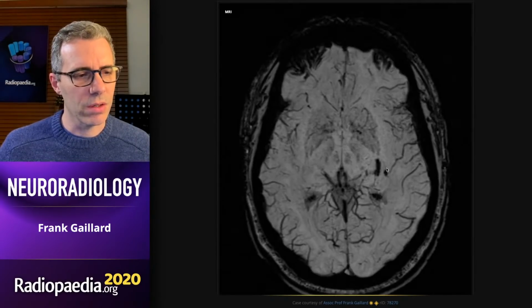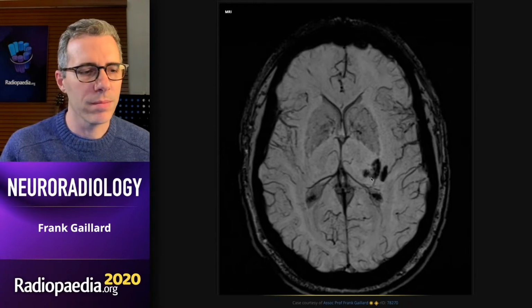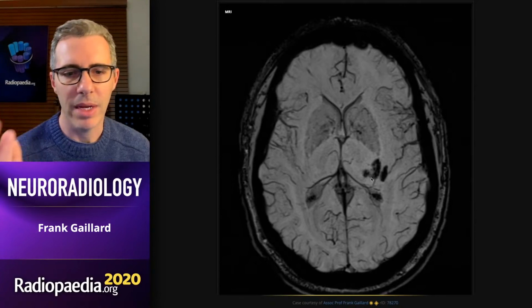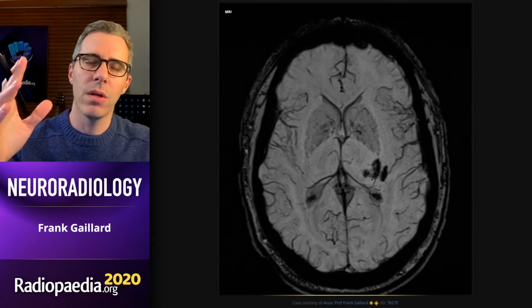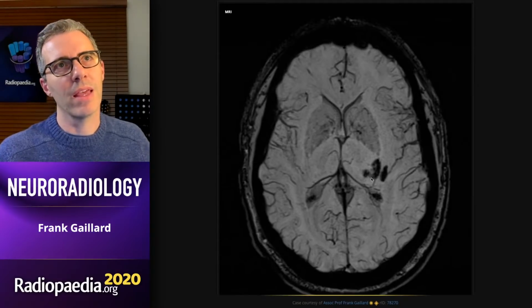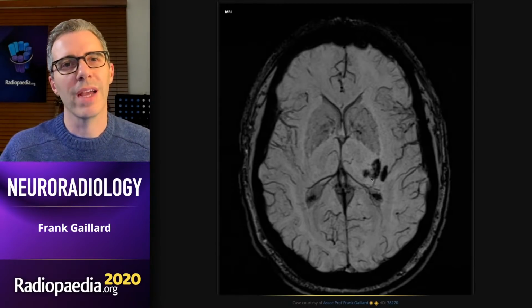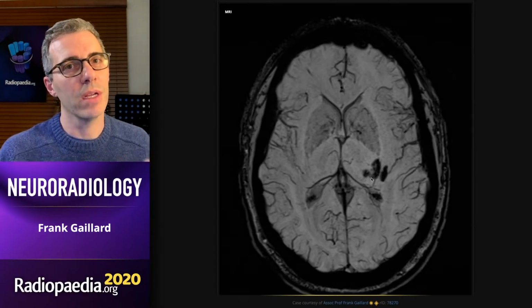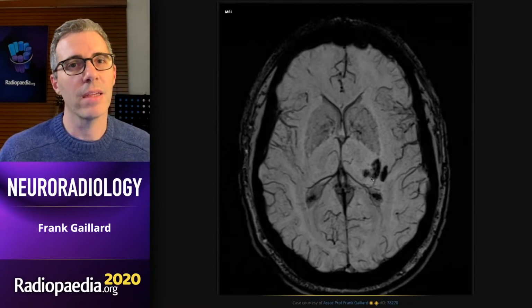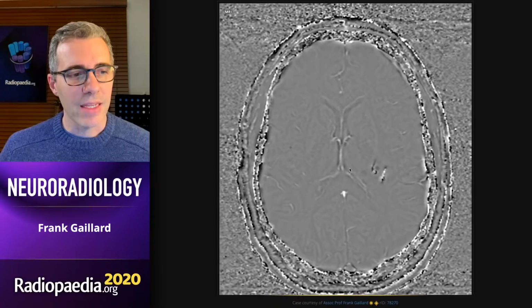So here we have these areas of susceptibility induced signal loss, but it doesn't really tell us on these maps what it's made of. Now, there are two ways that you can affect your magnetic field, and that's using paramagnetic and diamagnetic compounds. That's to do with whether they pull the field towards them or spread it out. So they affect the magnetic field in opposite directions, and the direction of phase shift that they have will be in opposite directions. So diamagnetic, like bone and calcium, will go in one direction, and paramagnetic, like deoxyhemoglobin and hemosiderin, will go in the other one. And the maps that you want to look at are these susceptibility phase maps.